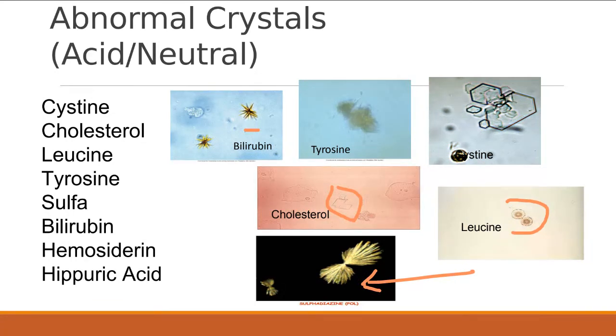And so you don't even have to worry about if you can't identify the difference between that and a white blood cell, because you're not going to see it. When we do diseases, you'll need to be able to know what that goes with. Or if I give you a list and say, if I had an acidic urine, then which one of these can be found? Or which abnormal crystal is found in an acidic urine? Well, you need to know the difference between normal and abnormal crystals also, right? So that can kind of help you to limit, but you won't see these in lab, not in any type of a urine. If we have a slide or something, that's different, but you will not have to identify them in any of the urines that we get because we'll have so many that are normal.